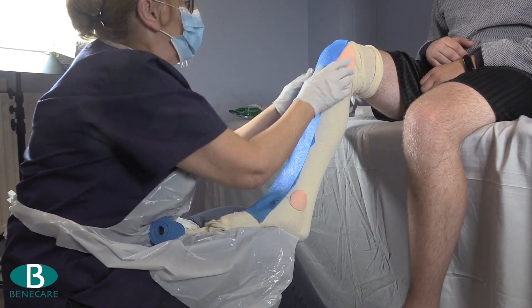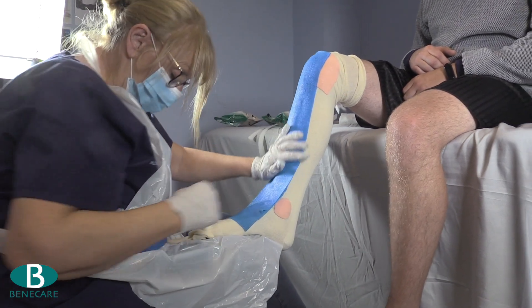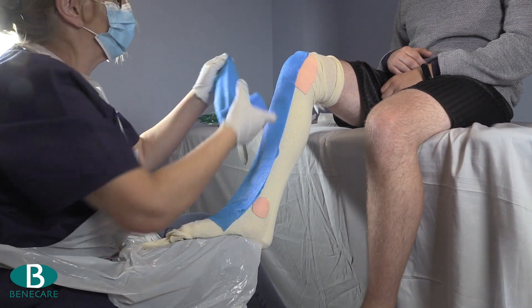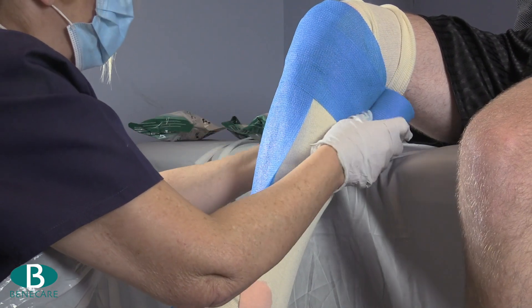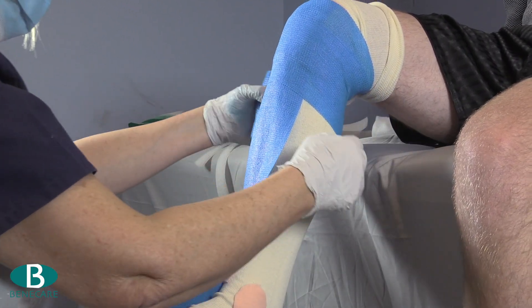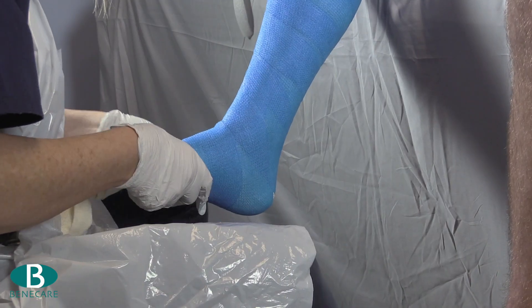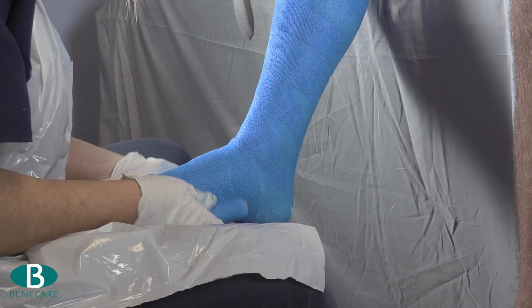Place the slab on the anterior aspect of the limb and then secure using the remainder of the bandage, covering approximately 50% of the previous turn. Use the remainder of the bandage around the foot and the ankle to provide additional strength.